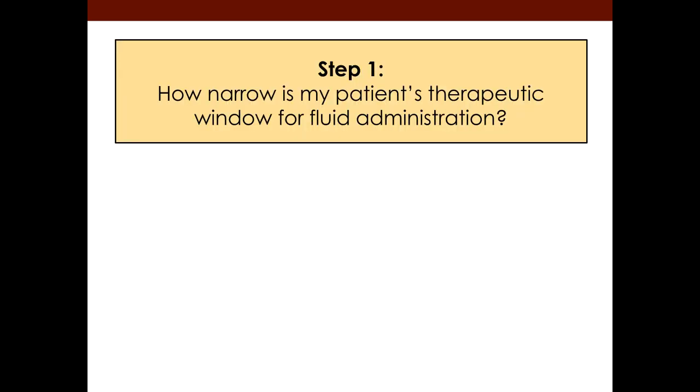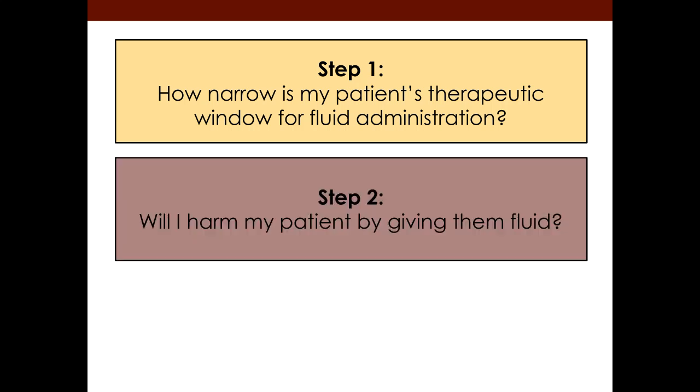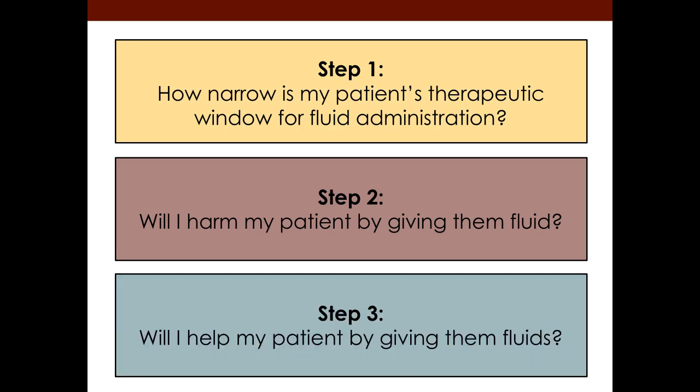I like to keep things simple, so we're going to do this in a 3-step approach. Step 1, how narrow is my patient's therapeutic window for fluid administration? Step 2, will I harm my patient by giving them fluid? And step 3, will I help my patient by giving them fluid? So let's go through each of these by turn and talk about how you can use ultrasound to help you answer each one of these questions.